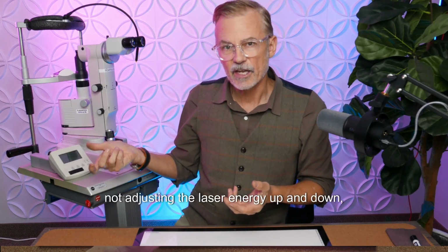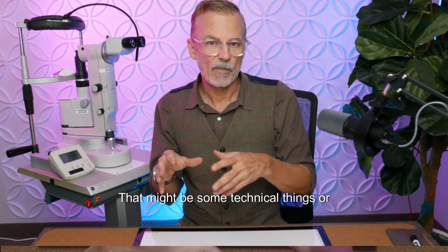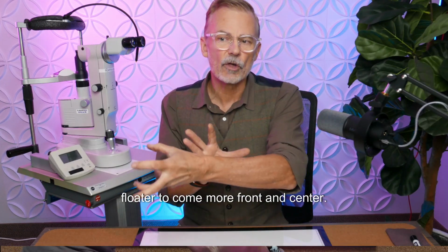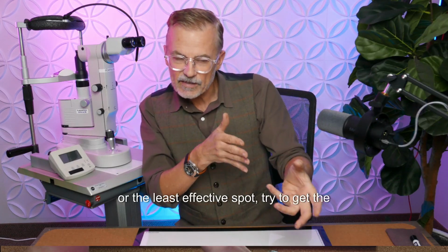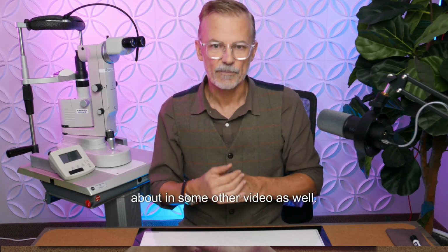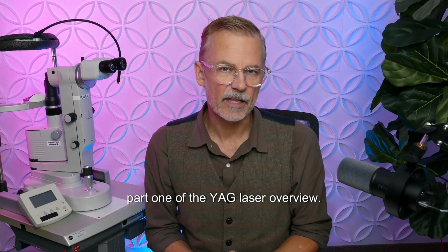Any number of things can affect how that energy is delivered. But surprisingly, I find myself not adjusting the laser energy up and down but improving the optics. That might be technique things like having the patient look left, look right, move things around, to try to get the floater to come more front and center. So rather than chasing it into the worst or least effective spot, try to get the floater to move into a better position. I'll talk about technique in some other video as well. That winds up part 1 of the YAG laser overview.